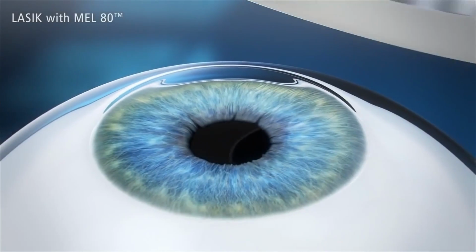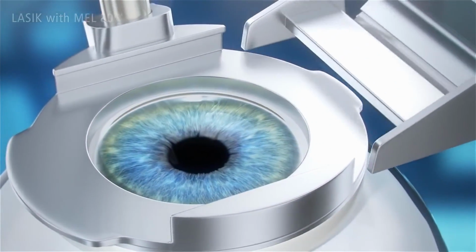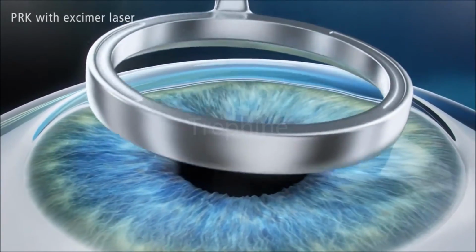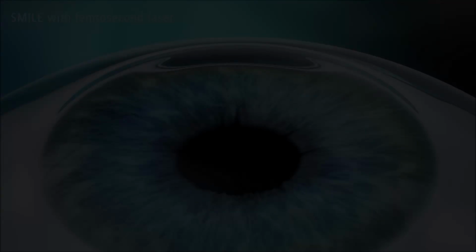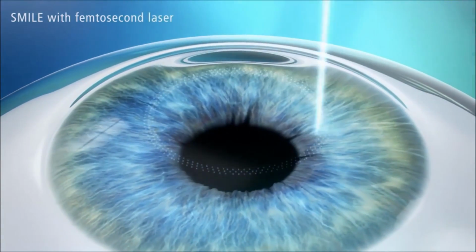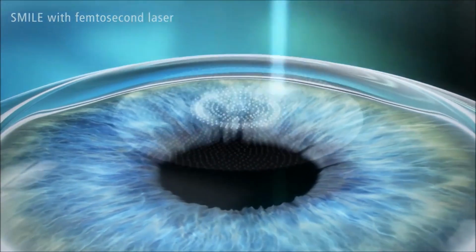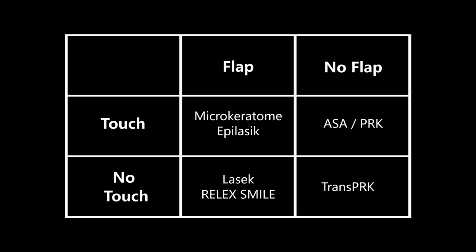As for the difference between touch and no touch, touch means there is something touching the eye in order to perform the surgery, be it a blade or a circular tool called a trephine. No touch means only lasers are used to create the flap or ablate the epithelium with no need for any blades. Now, let us quickly run through the types of flap surgeries.